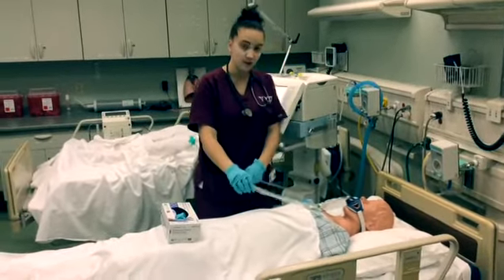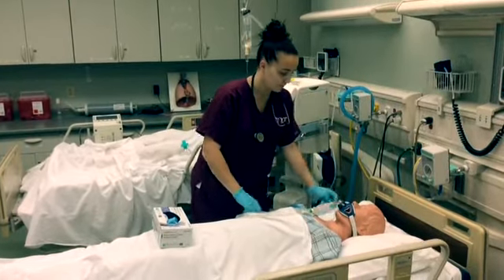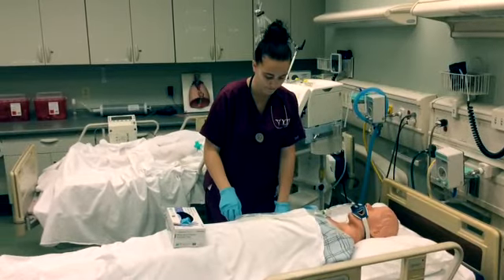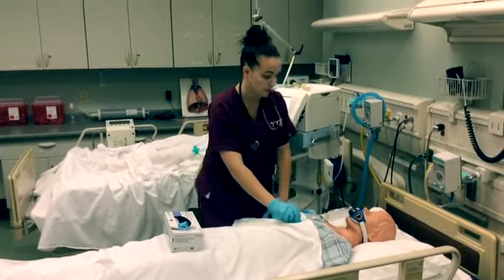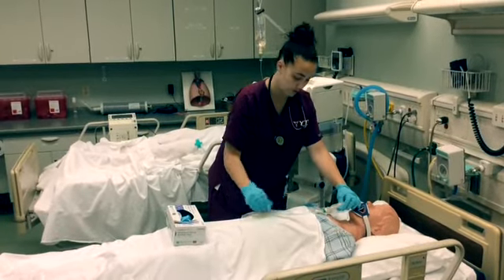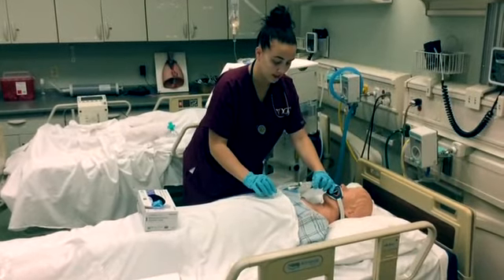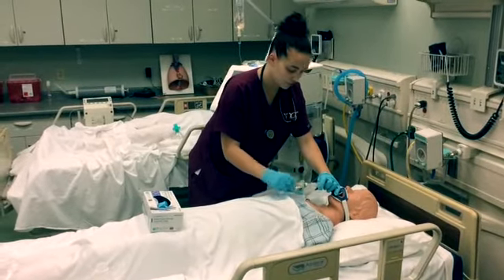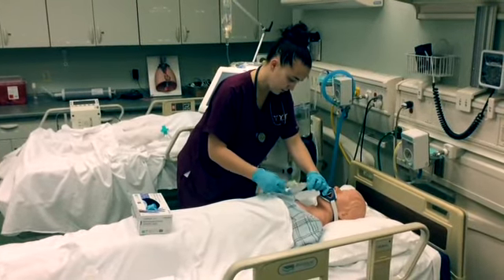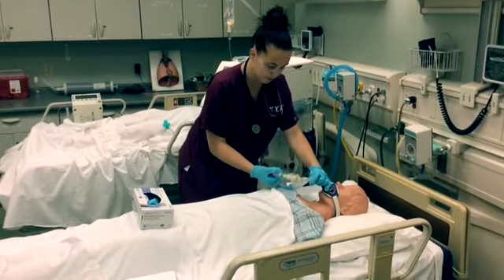We have our inline suctioning with our tube to our suction canister. We have our vent here on standby with our oxygen as well. Now to start our closed suctioning, always hold your endotracheal tube. We're going to hold on to our tubing, and this has to be done in 15 seconds or less. You're going to put your tube down through until you meet resistance, and then you're going to squeeze and pull.